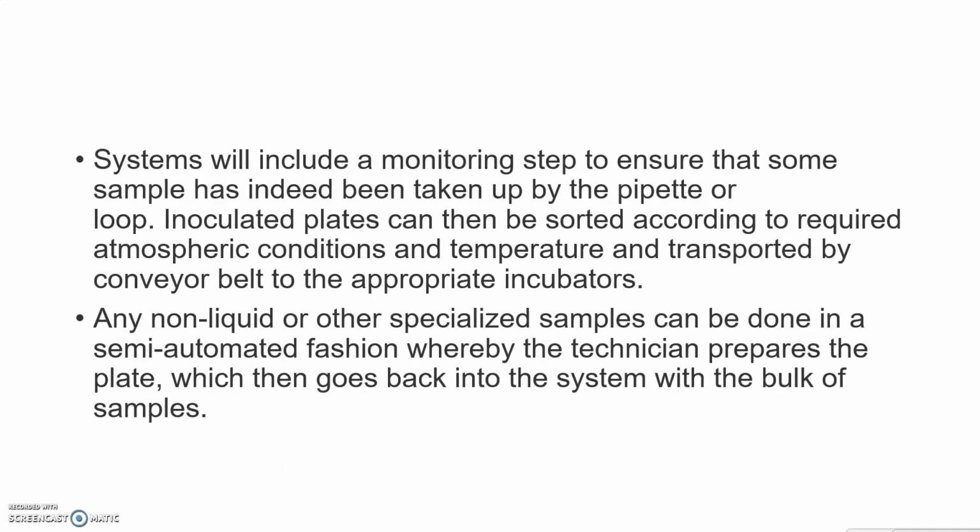The system will include a monitoring step to ensure that some sample has indeed been taken up by the pipette or loop. Inoculated plates can then be sorted according to the required atmospheric conditions and temperature and transported by conveyor belt to the appropriate incubators. Any non-liquid or other specialized samples can be done in a semi-automated fashion, whereby the technician prepares the plate, which then goes back into the system with the bulk of samples.